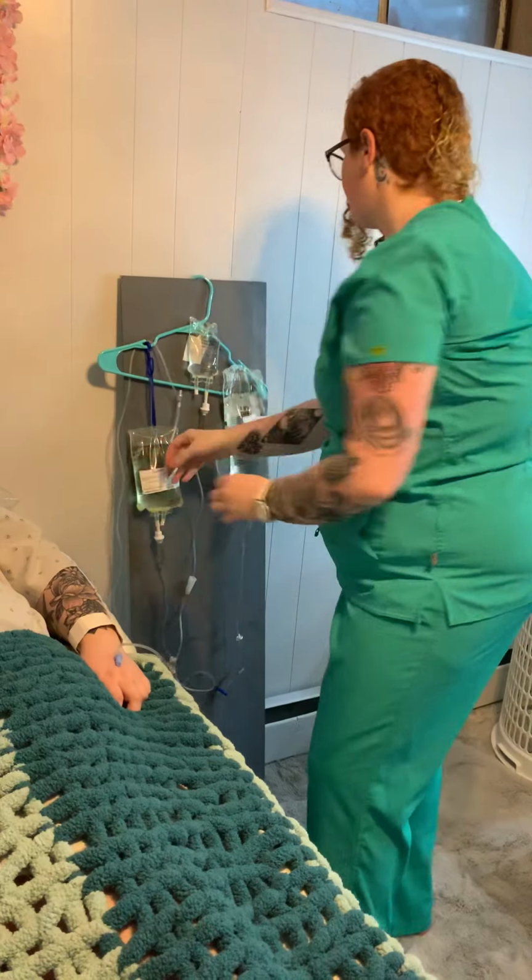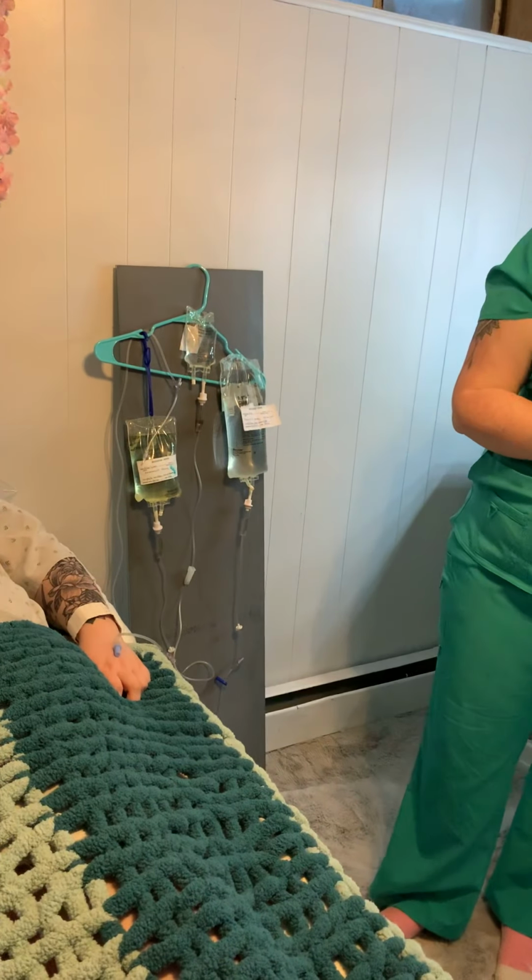And we will reestablish our primary IV to 125 mLs per hour. And that concludes the skill. Oh, and I will document everything that we did today.